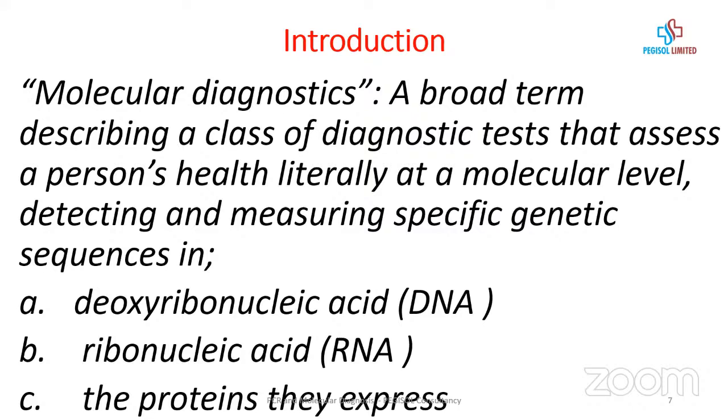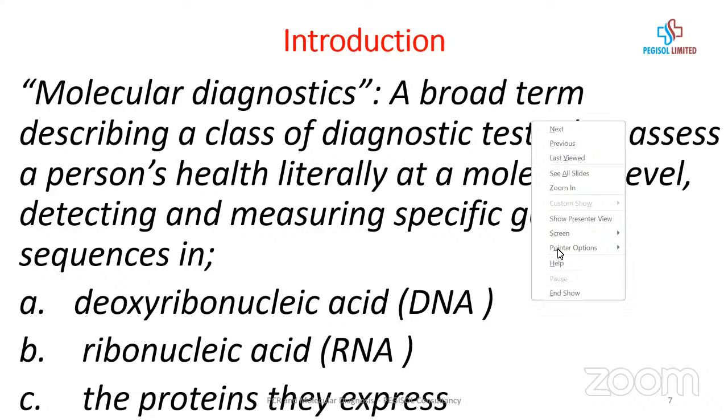All right. So the first thing I usually discuss with people is for them to understand what molecular diagnostics means as a concept. And I usually try to use this slide or this definition provided by the WHO on what molecular diagnostics encompasses in general terms. So it says that molecular diagnostics is a broad term that describes a class of diagnostic tests that assesses a person's health. Of course, you know our job on the bench is to assess a person's health using the clinical specimen. But this time around, we're looking at testing at the molecular level, and we're able to look at the concept of how to detect and measure specific genes. So the definition is trying to let us understand that we are now doing testing at the molecular level.